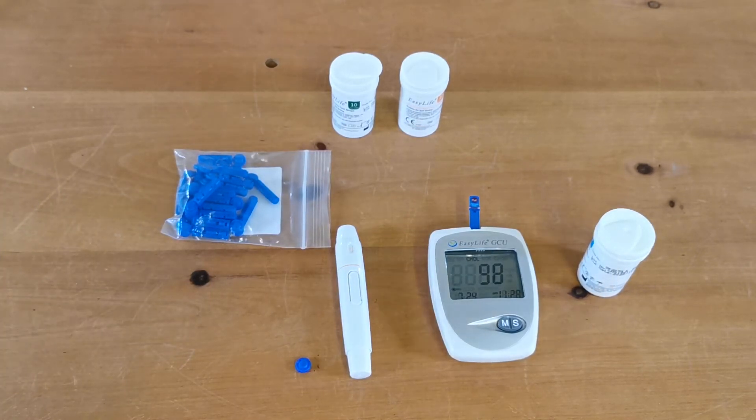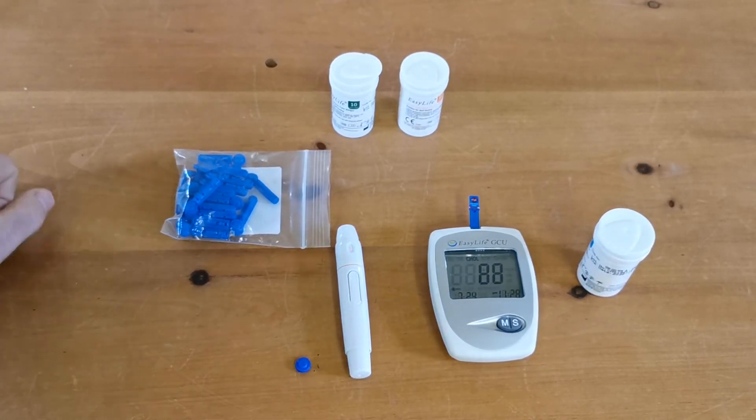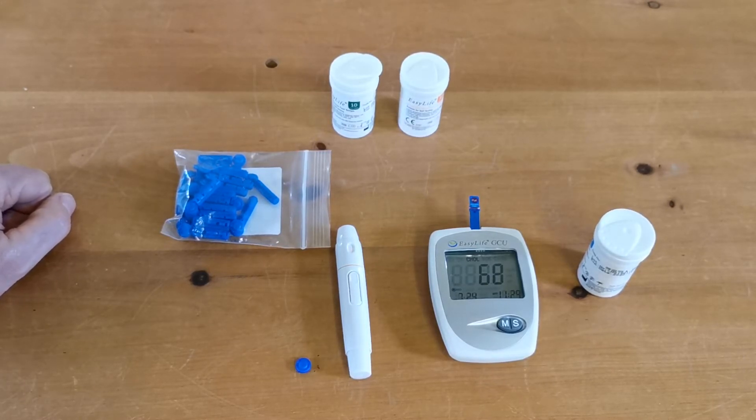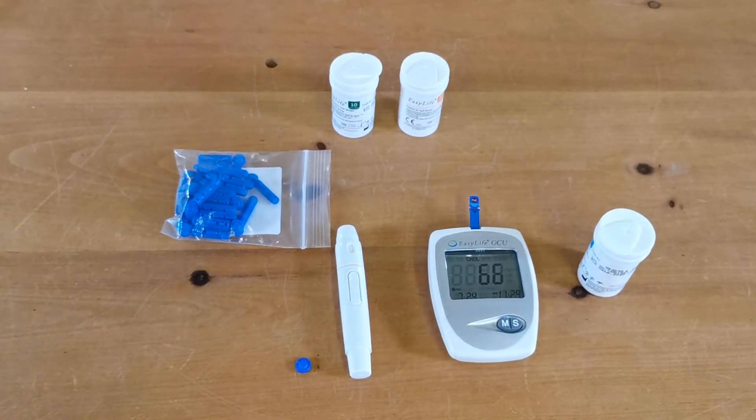While we wait, a note about control solutions: people are often confused when they first buy this meter as to whether they have to purchase a control solution to test the meter function. The answer is no — you would only need to run a control solution test if you were suspicious that the readings were not accurate. For each separate batch of test strips, control solutions are available through the ValueMed website, allowing you to run controls at standardised solution concentrations to verify that both the test strips and the meter are functioning within the manufacturer's preset parameters.